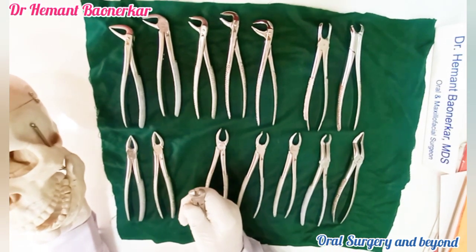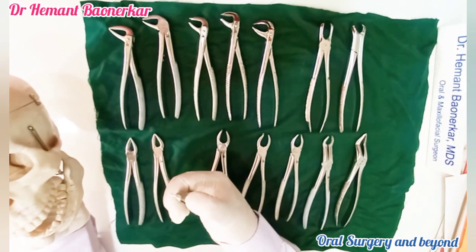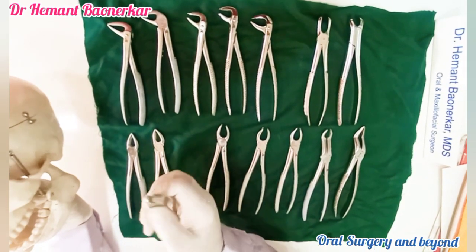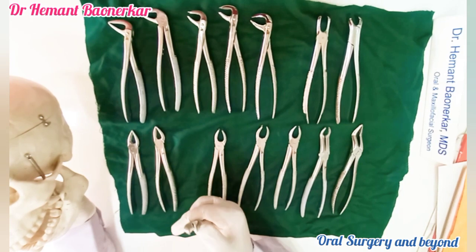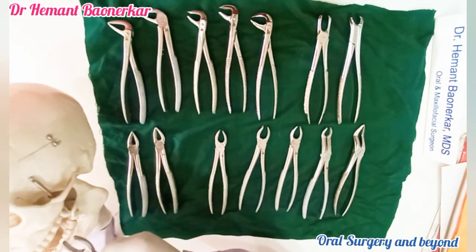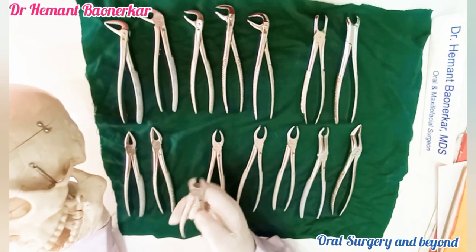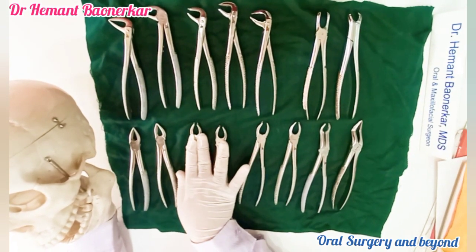Now this is the molar forceps. We can see there is a small beak on one end of the extraction forceps. This beak is for the engagement between the two buccal roots of the molar. These are always a pair — maxillary molar forceps are paired instruments. This one is for mostly the patient's left side. We can hold this extraction forceps to the molar like this — this tip goes between the buccal roots and this beak goes to the palatal roots. This is for the second quadrant maxillary molar forceps.